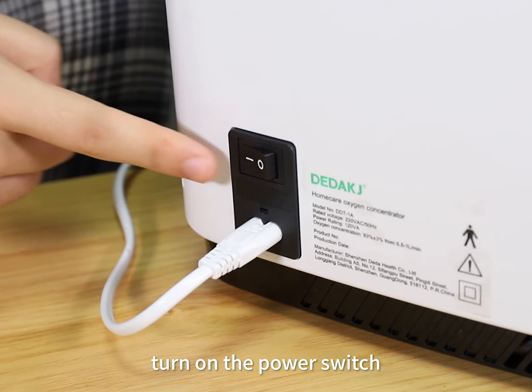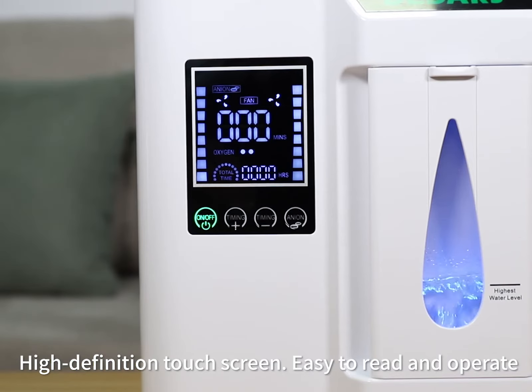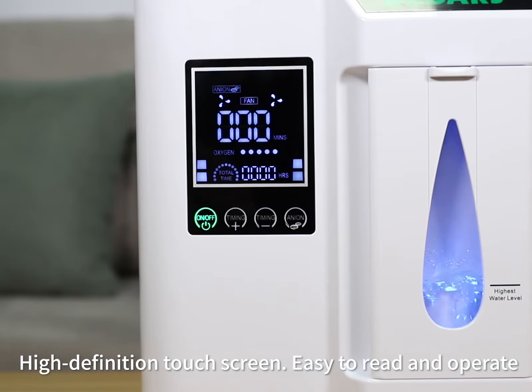Turn on the power switch. One button start. High definition touchscreen — easy to read and operate.